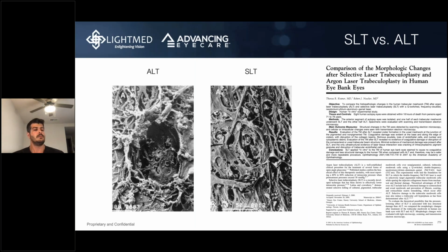What happens if the ciliary body or another structure is hit with the laser? Is it just that there is no effect on IOP? Number one, no effect on IOP. Number two, that's the one that the patient might feel. Ciliary body has a lot of nerves in it. Even during surgery, for anyone that does cataract surgery, if any of your instruments touches the ciliary body, that's when the patient jumps. So your patient might feel it.